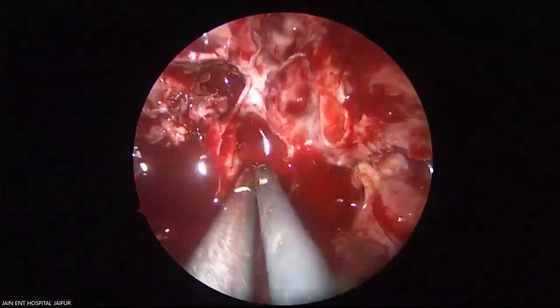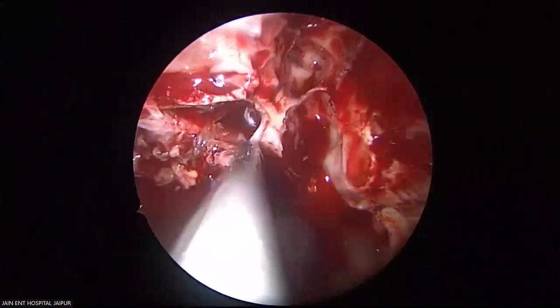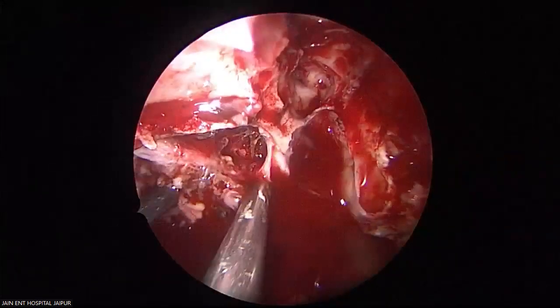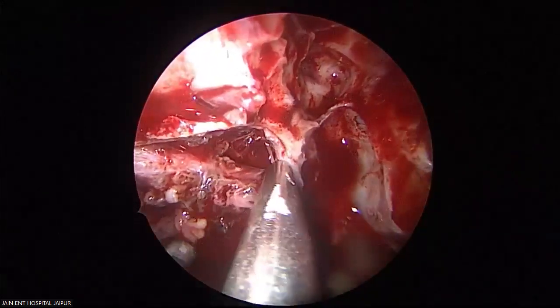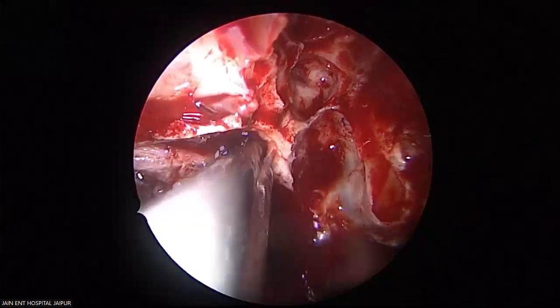Now coming laterally, see this is pterygoid. This is the superior orbital fissure. See, this is your V2 going below. V2 is just lateral to the suction here, and the superior orbital fissure is just above.